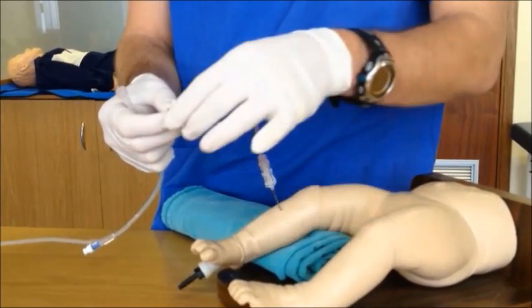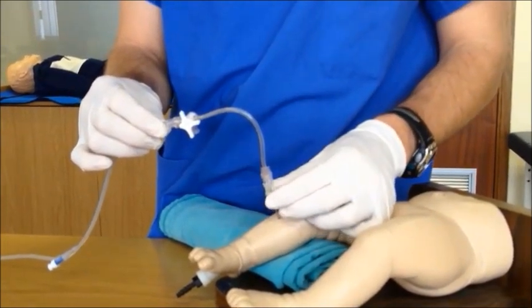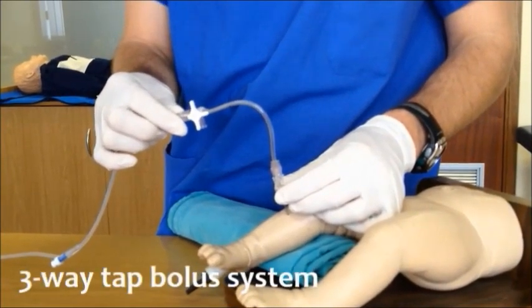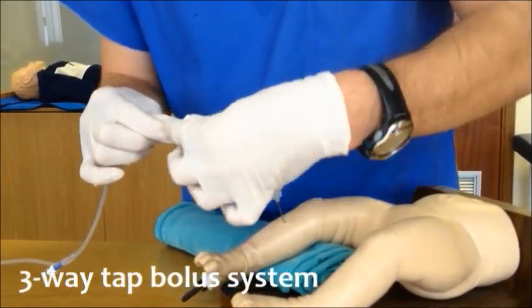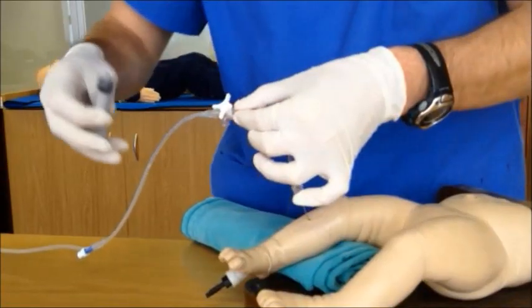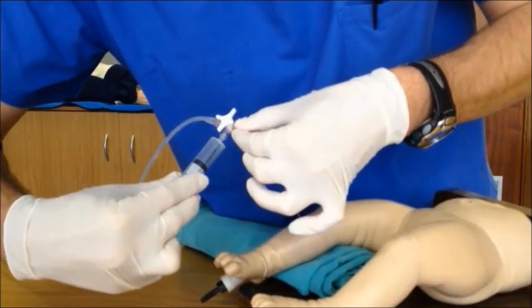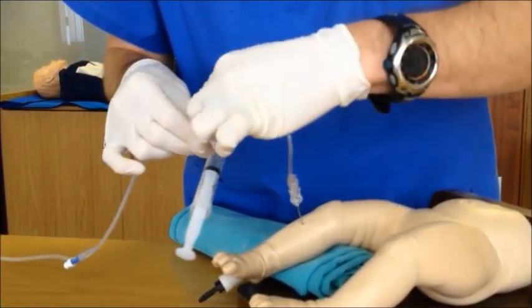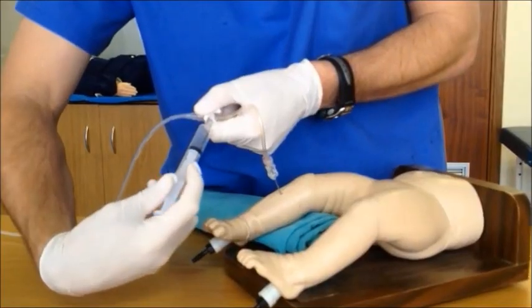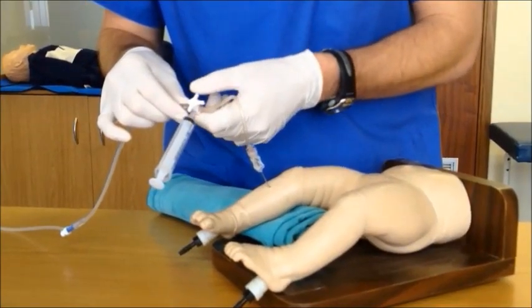Once an assistant has taken over, attach your giving set. It's very important to note that gravity alone is not enough to infuse fluid into the patient — you would have to use a three-way tap bolus technique to do that. Make sure that the tap is open to the syringe port and open to the intravenous fluid bag. Attach the syringe to the port and aspirate the required amount of fluid from the bag. Then make sure that the system is open from the syringe to the patient and deliver the fluid as needed. This process can be repeated, and the side port can also be used to deliver medicines.